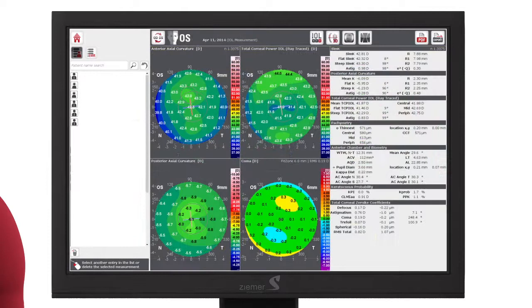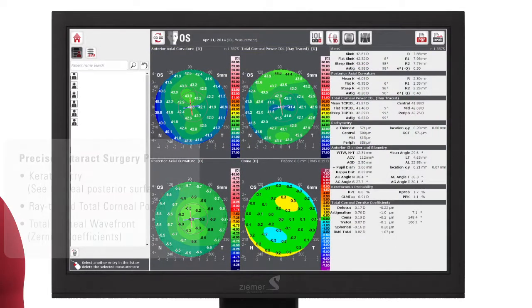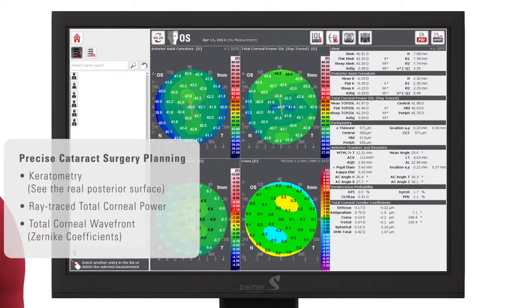The advanced report provides you with the information needed for cataract surgery planning. Anterior and posterior corneal curvature can be analyzed. Total corneal power and wavefront coma map help assess total corneal astigmatism and asymmetry.